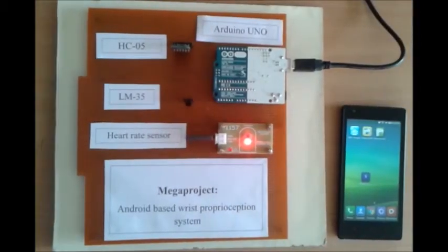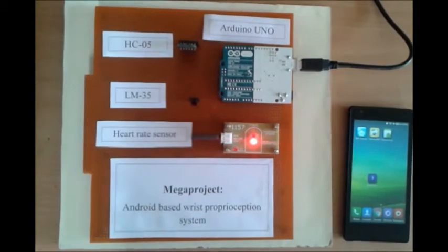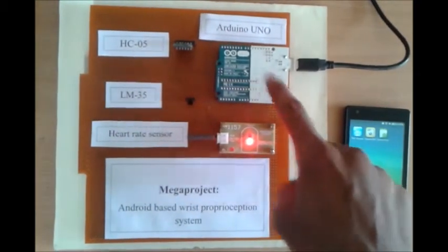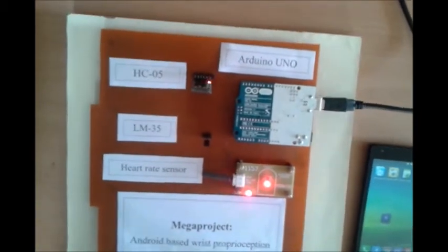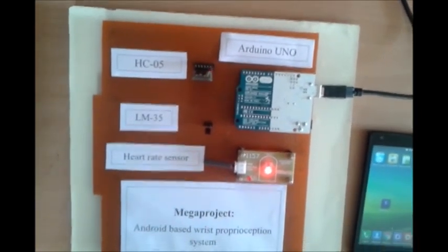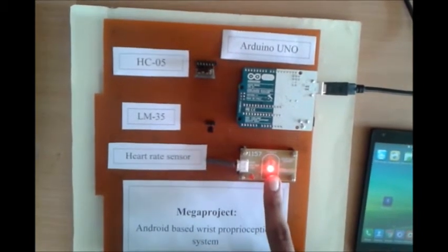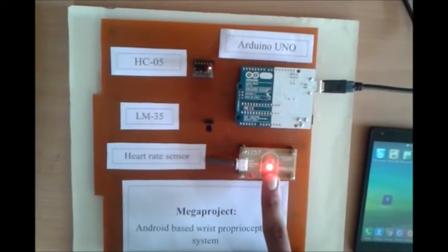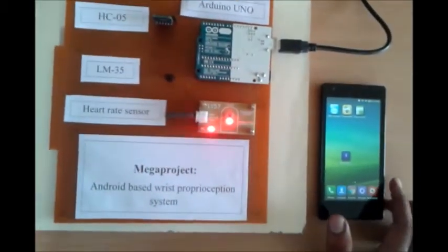Okay. So friends, let us start with the demo. The program is already loaded in Arduino. This is HC05, and for now we can see the HC05 is blinking, which indicates that it is not connected to any other device. Also, the pulse sensor is showing a red glow, which means it is given a 5 volt supply. Let us start with the Android application.